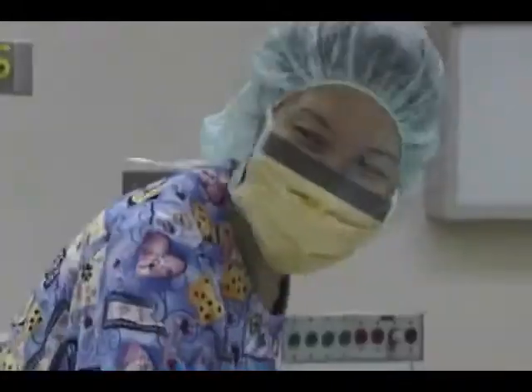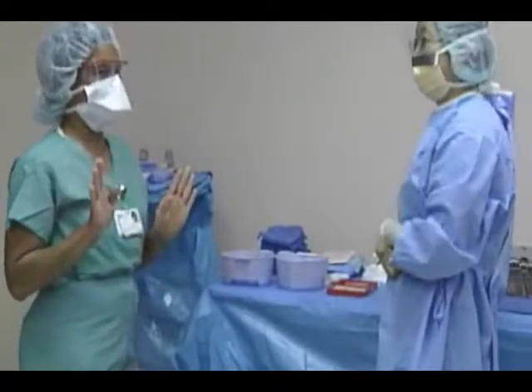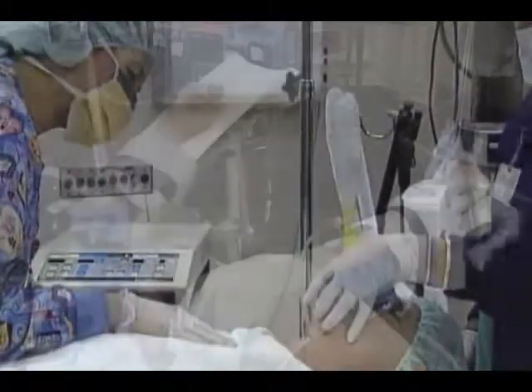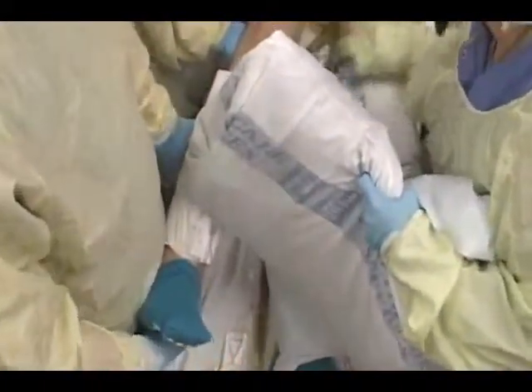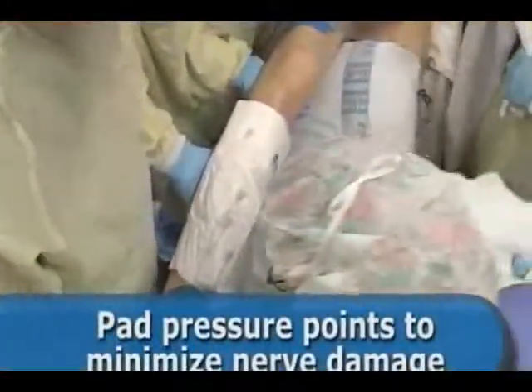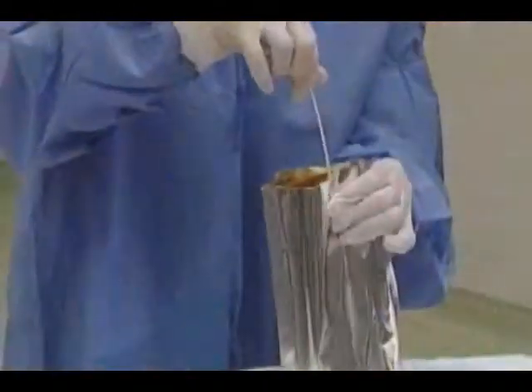As the patient falls asleep and sensitivity to noise increases, the surgical team should avoid talking loudly or making unnecessary noise. After anesthesia induction and intubation, the team positions the patient so that the incision site is easily accessible. The circulating nurse pads areas which need additional protection from injury, such as nerve damage.